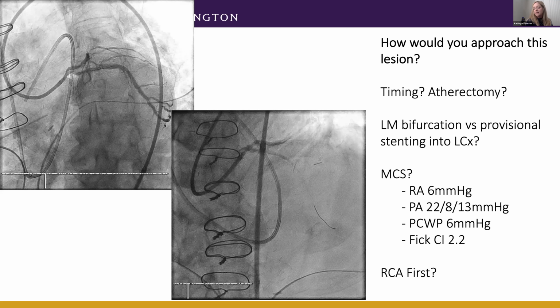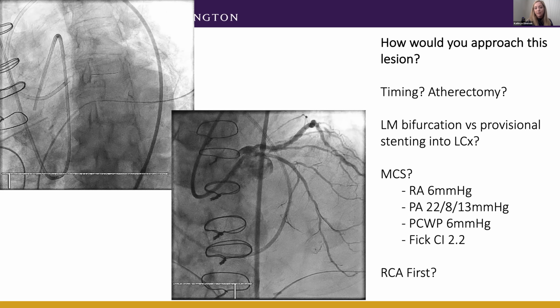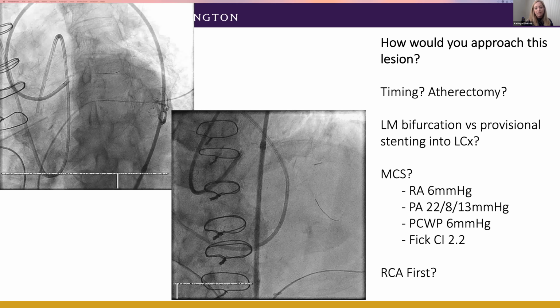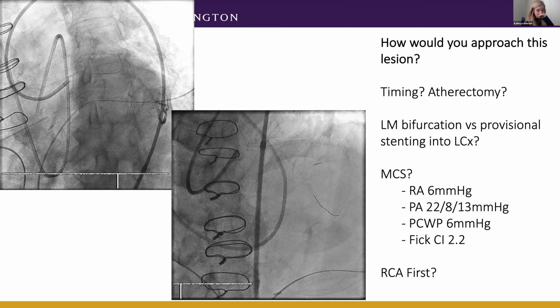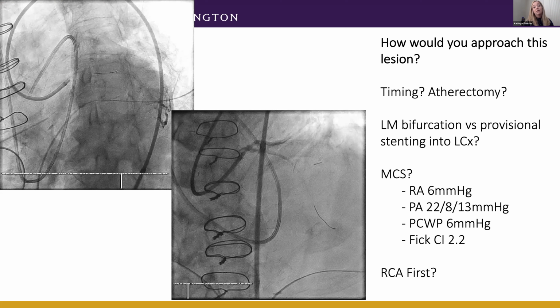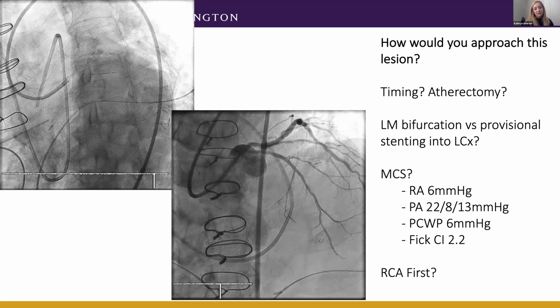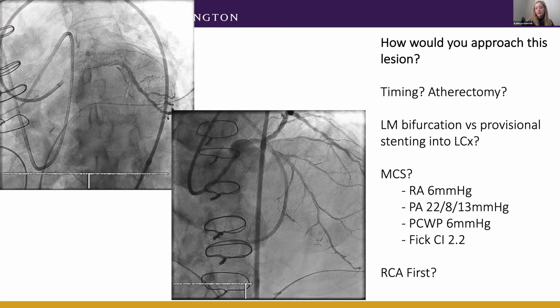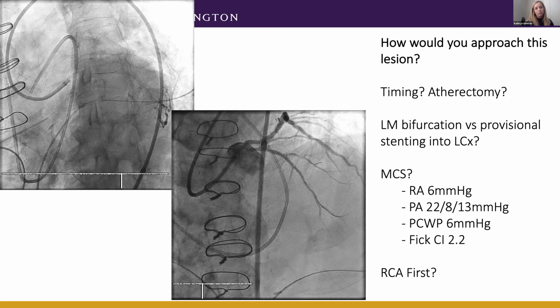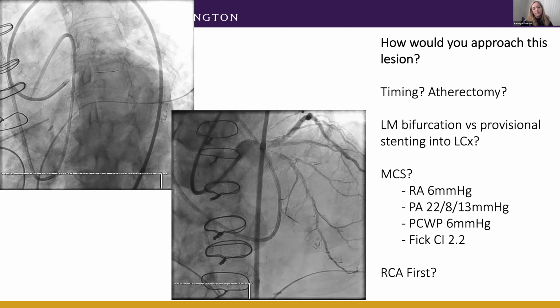That's right. And from my hospital, I know that Dr. Kate Carney is on, so I'm happy to have her weigh in as well regarding our typical approach to this sort of thing. But my experience, at least in the first year, has been that we typically go with 8 French guides from the groin when we're worried about high risk cases like this, where we're going to war and trying to get the job done as efficiently as possible. And as you said, we always use ultrasound, fluoroscopy, and micropuncture access for the groins, trying to minimize those complications as much as possible. So that was what we did here.